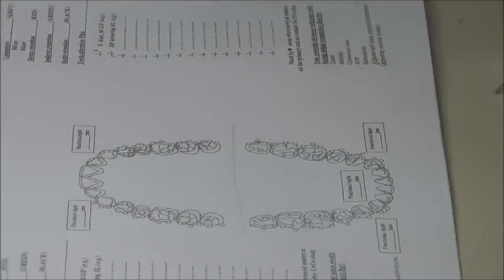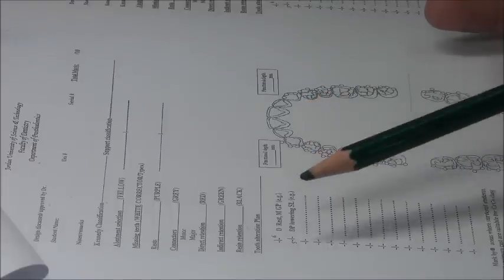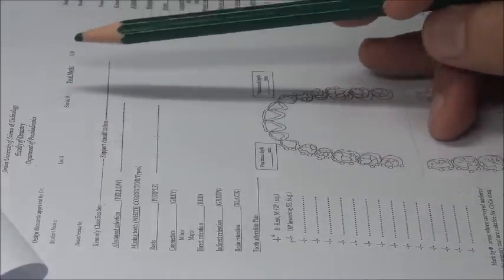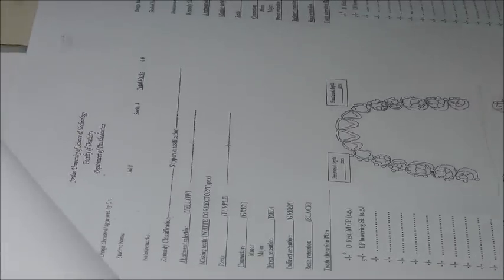If we go to the second page, we said it's an empty form. This is the form you fill in, and it has the following components. It has your student name, your university number, your serial number, and some notes and remarks if you have any on this patient or on this cast. So it also indicates any notes or remarks.